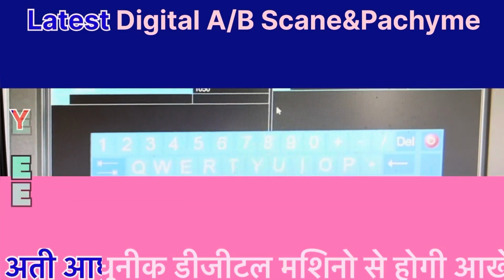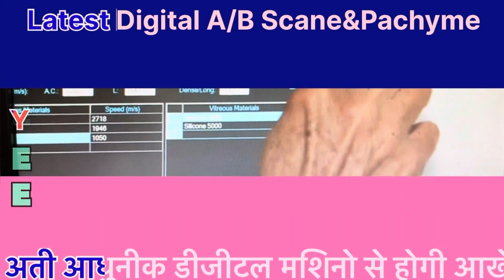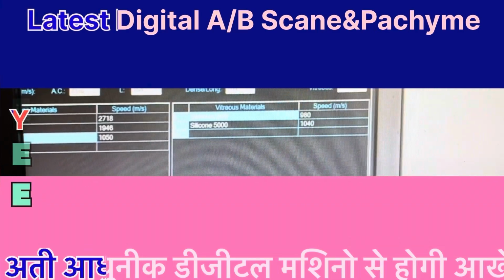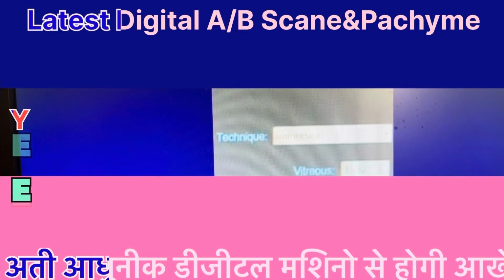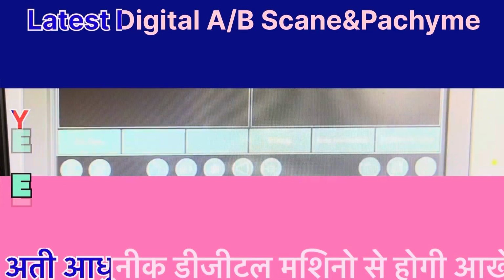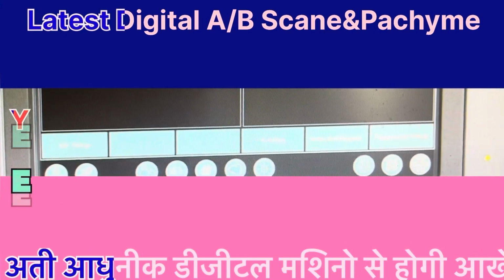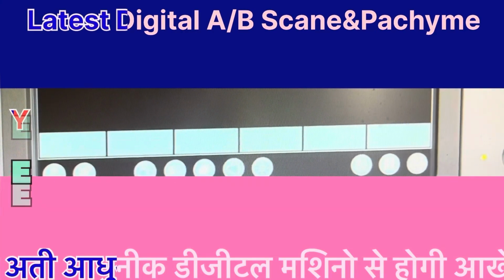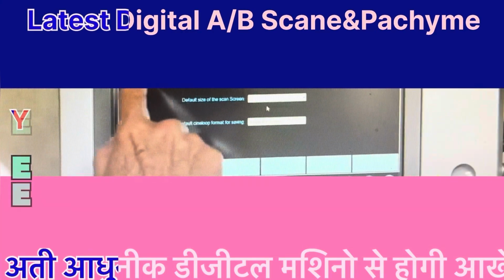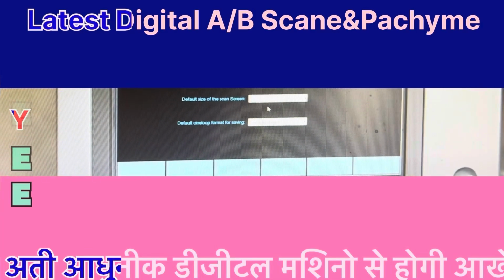In addition to first and last names, default values for such parameters as gain, dynamic, DYN, and time gain control, TGC, can be set. Once details have been entered, save the profile via the Save icon at the bottom of the screen. Next, in the Technique field, choose Contact to use the A-scan probe for applanation scans, and Immersion to use the probe with a scleral shell and coupling medium.